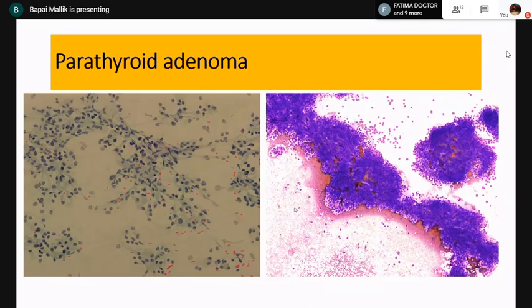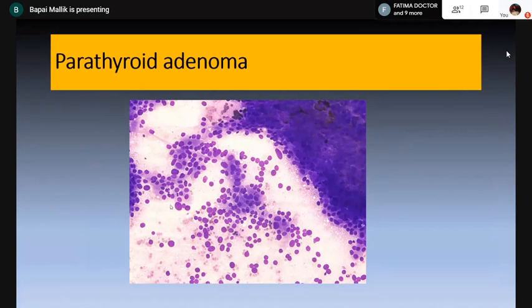So this is what you see, some element of anisonucleosis. The vacuolations are particularly useful sometimes if you see them. And this anisonucleosis and strip nuclei of course help, and you can put in a possibility that this could be a parathyroid adenoma. But it requires support from biochemistry and other clinical features. And if you have parathyroid hormone in your lab, you can use it, or you can stain them with thyroglobulin and you'll find that they're negative. And calcitonin negative, I guess.